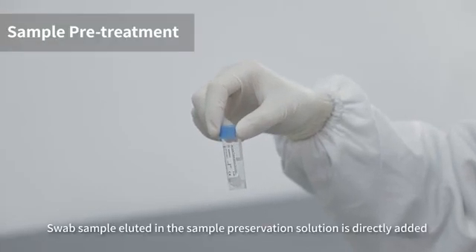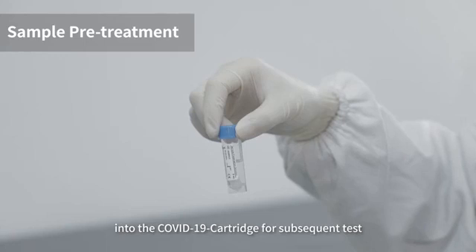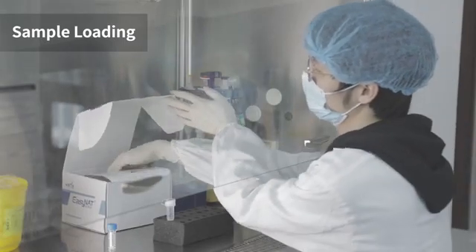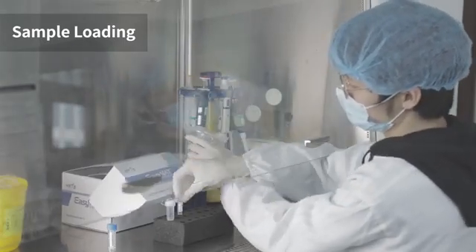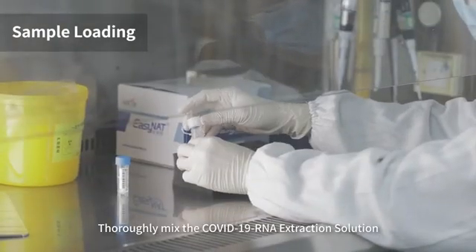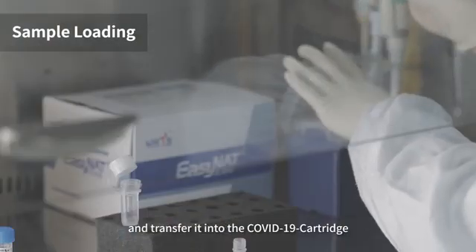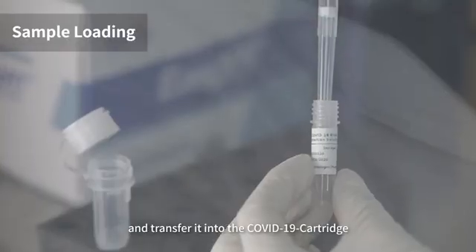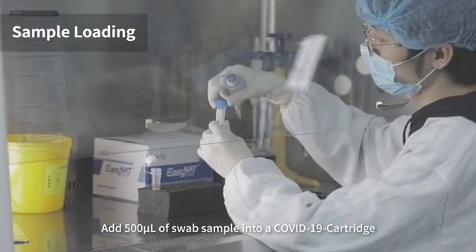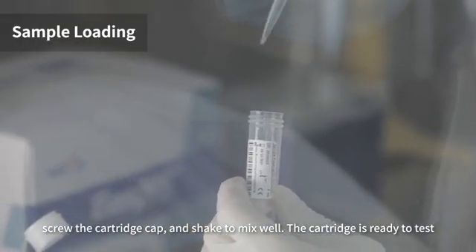Sample pretreatment: the swab sample eluted into the sample preservation solution is directly added into the COVID-19 cartridge for subsequent testing. Thoroughly mix the COVID-19 RNA extraction solution and transfer it into the COVID-19 cartridge. Add 500 microliters of swab sample into the COVID-19 cartridge, screw the cartridge cap, and shake to mix.